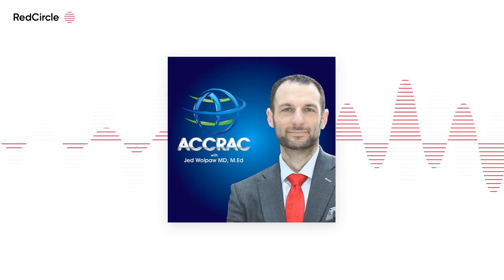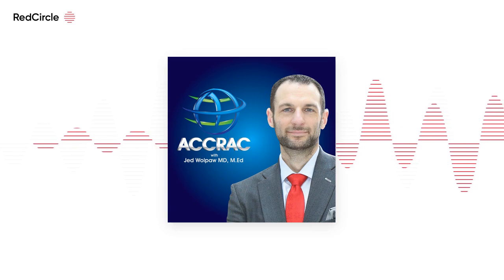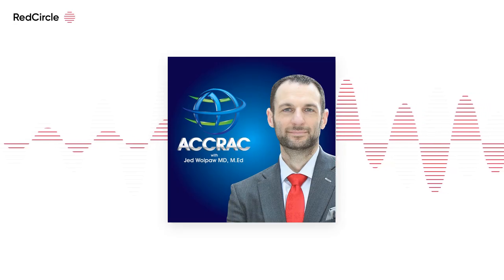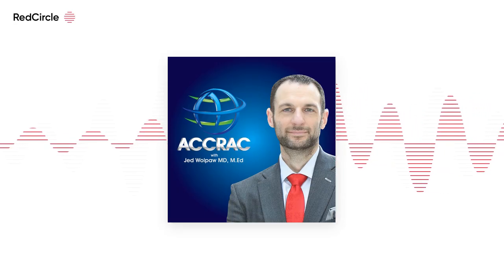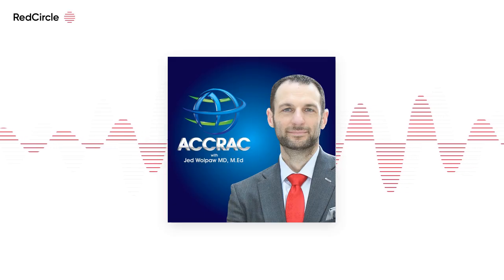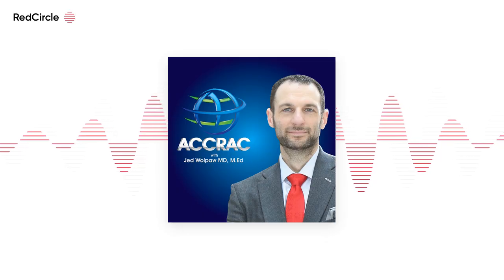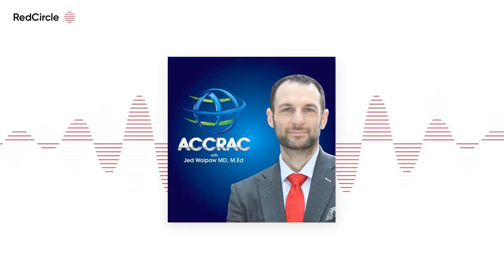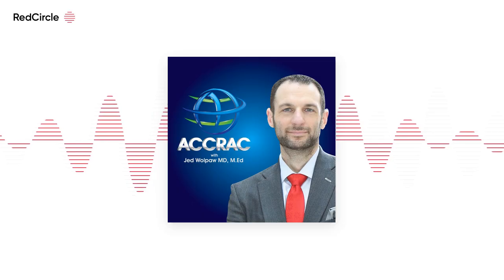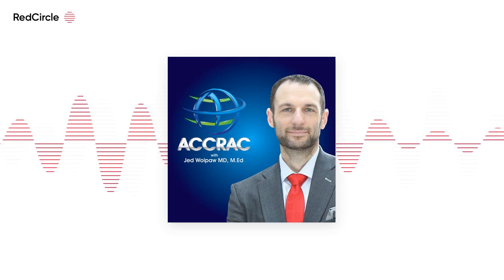But compliance itself is also a bit tricky. We've done a number of EIT studies now, and what we're finding is that the optimal respiratory system compliance often correlates with an increasing degree of collapse that is occurring. Now, what you're finding is that there's tidal recruitment, so the compliance looks like it's getting better and better. It's not so much atelectasis that is not recruiting. It's the fact that it's opening and closing, and that opening and closing is not being reflected in the respiratory system compliance. So it's tricky. We think we should go by the best compliance out there, but that's often associated with collapse.